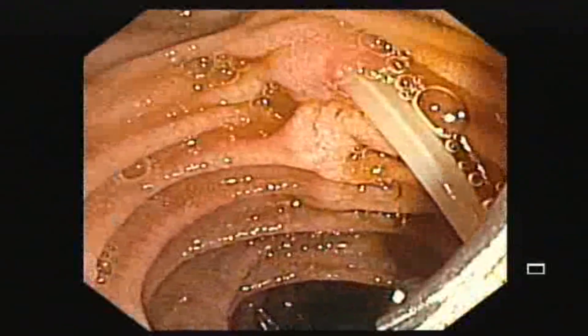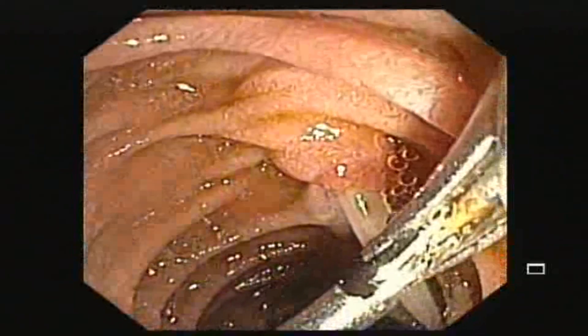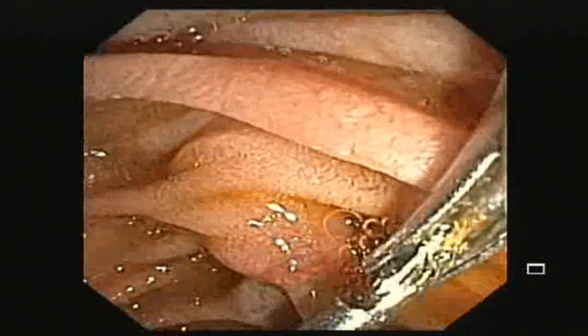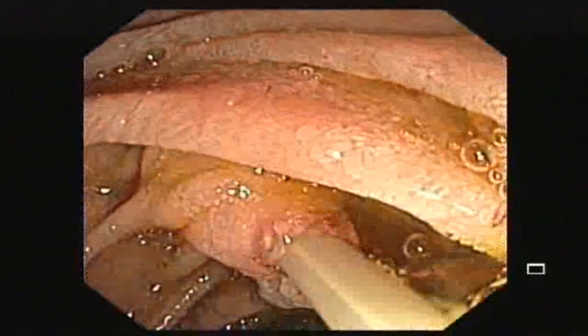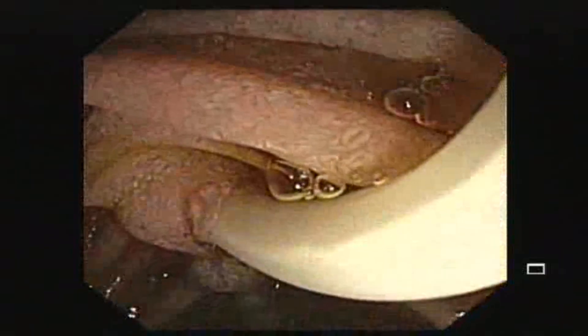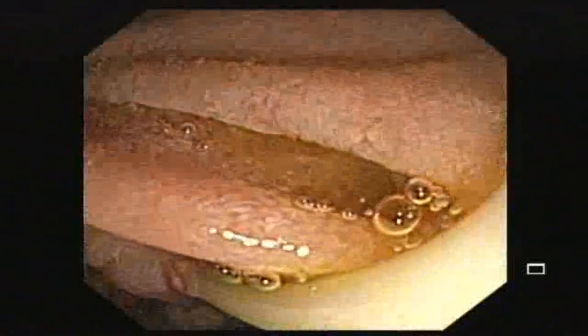ERCP shows an ascaris worm in the biliary system. A foreign body forceps was passed through the working channel of the duodenoscope. Here you can see the worm is caught in the foreign body forceps and taken out through the working channel of the duodenoscope.